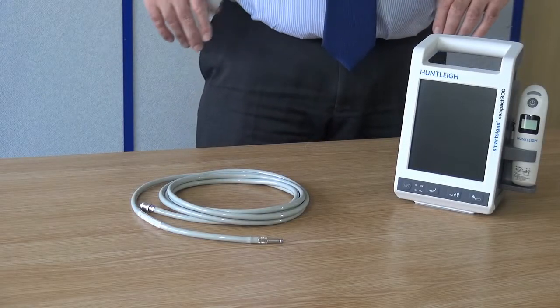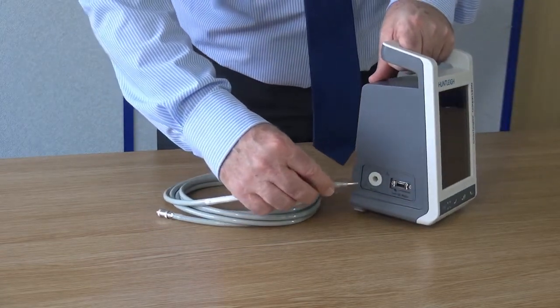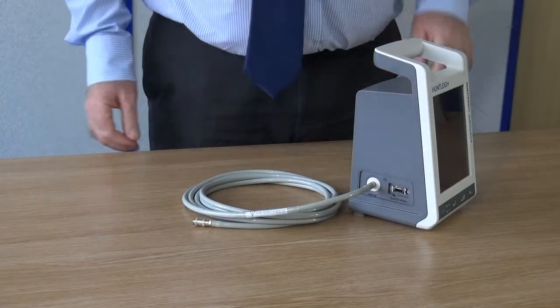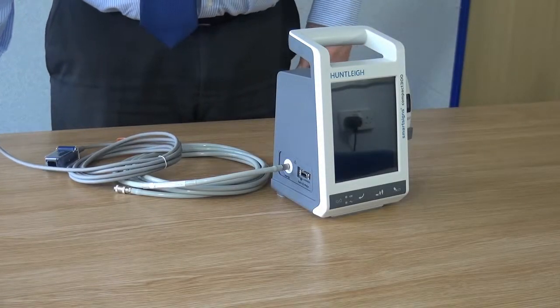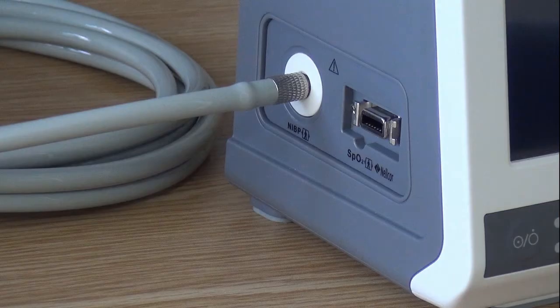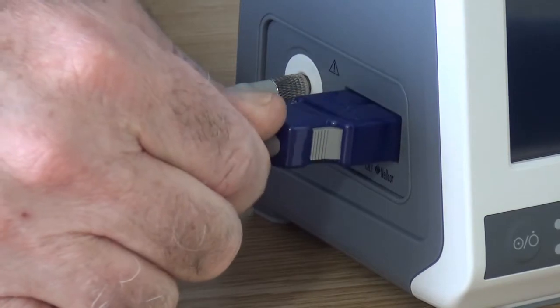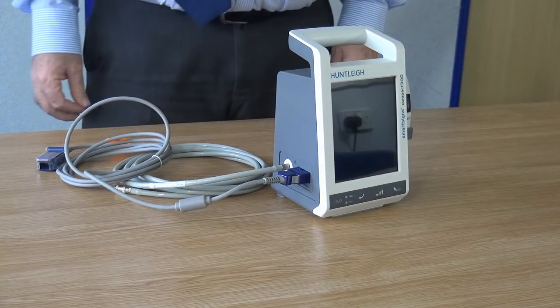The blood pressure socket is mounted on the left-hand side of the unit, marked NIBP. Push fit the hose into position. The oximetry socket is located on the left-hand side of the unit, marked SpO2. Check the polarity of the socket and offer the connector into position. Make sure the socket fits with a snap.